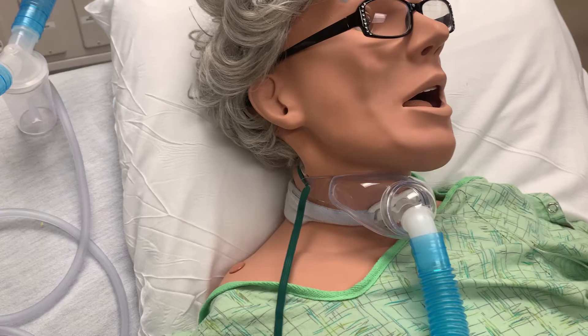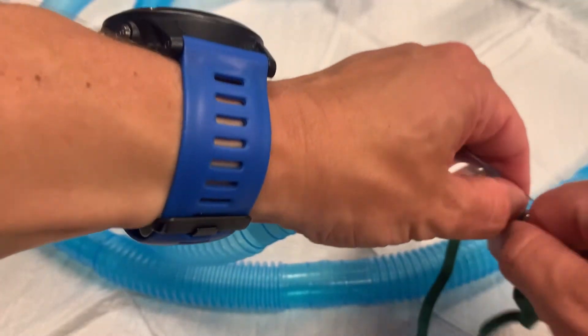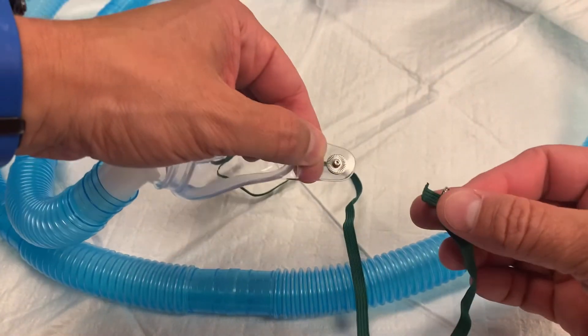The hose is attached to a collar that sits over the patient's tracheostomy, delivering oxygen to the trach like a venturi mask delivers oxygen over a patient's nose and mouth. The collar can be tightened or loosened, and one side of the strap has a snap to allow it to be easily disconnected.